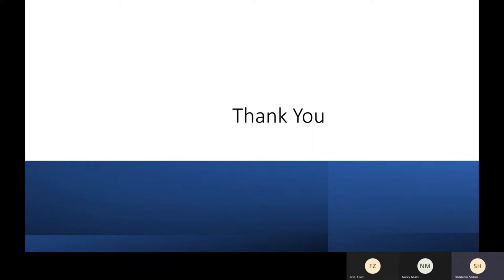It's hyperinflated. So what are you going to say with these findings, the spirometry and the total lung capacity and everything? It looks like asthma to me. No, guys, you're an interpreter. You don't say diagnosis, you're going to write a report. If you say asthma, people will take it as asthma because you're a pulmonologist. But that's a hyperactive airway. Not all hyperactive airways are asthma. So what's your interpretation?